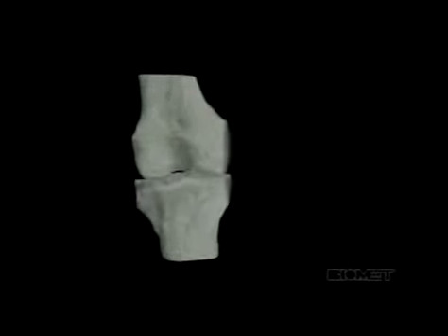Now, this next clip here, what happens is there's software. You can roll this next clip, and the computer will generate a three-dimensional model that's an exact replica of the individual's knee. Again, no two people are exactly the same. No two knees or hips are exactly the same. And this is how we try to generate a model that is, again, precise in every respect for the patient. This is an individual knee. No two are exactly alike.